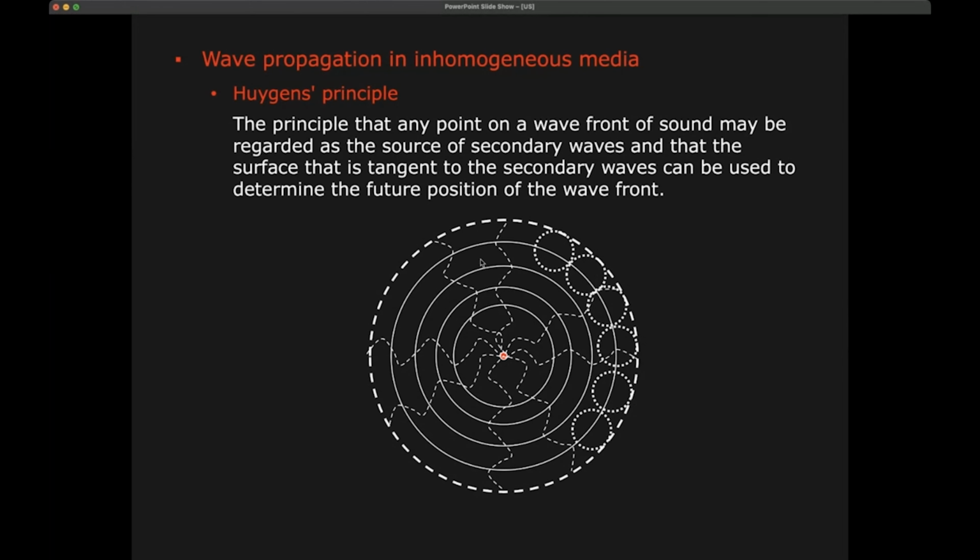So a little bit later we have this wavefront, which is where the wave propagated at that moment. To calculate the next one, we consider every point here again as a spherical emitter. It emits a spherical wave, and the resulting wavefront is the sum of all the individual spherical waves of the particles where the wave came the previous time.